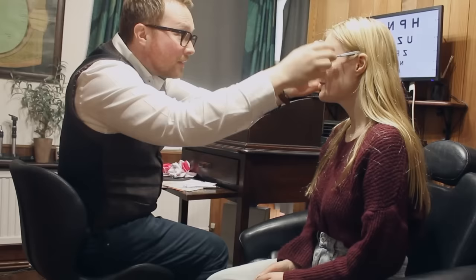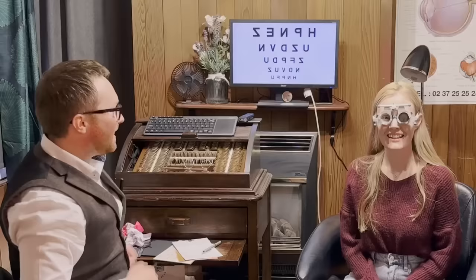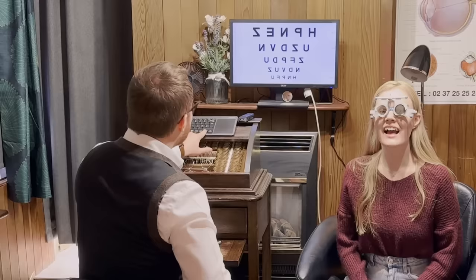But importantly, how do they feel? Comfortable? Brilliant. Let me know if they start to get a bit uncomfortable though. So we're going to make them even more stylish by covering one eye up. And we're going to have a look back at the letters in the mirror there, which should hopefully be a little bit clearer than they were previously.